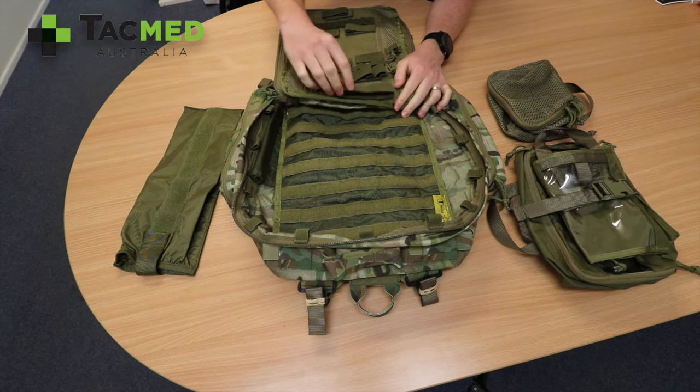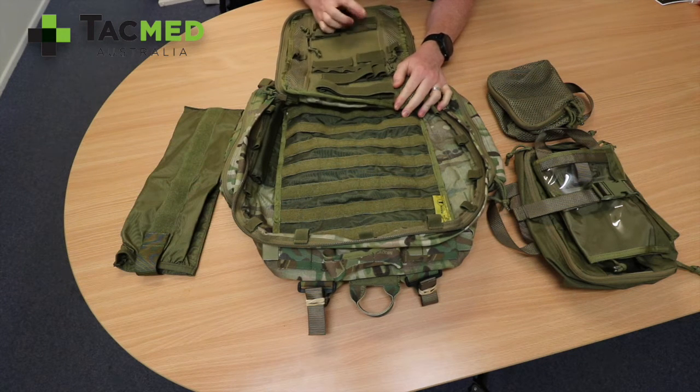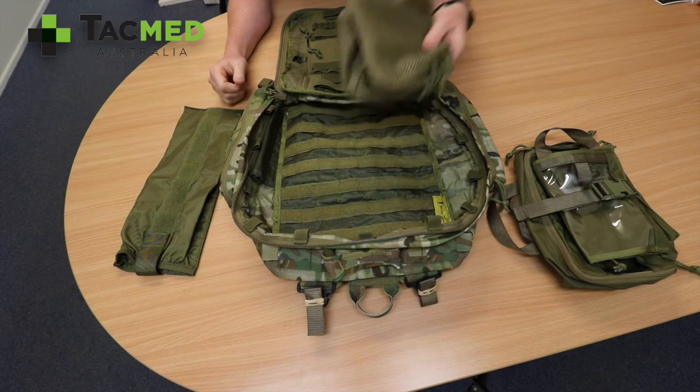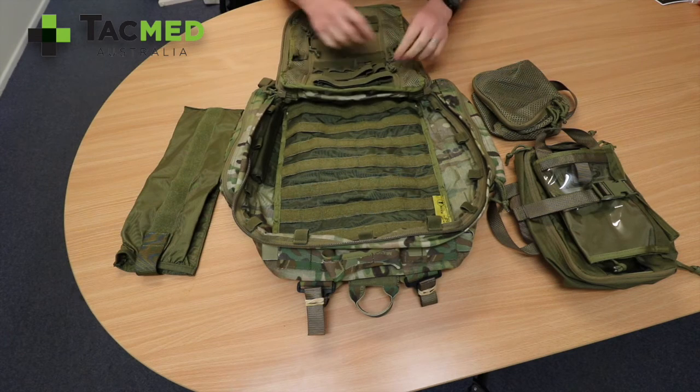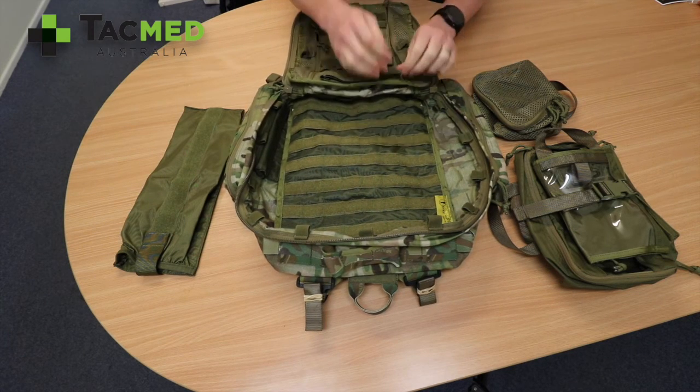On the top there are multiple elastic straps — they're in no particular order and you set them up for whatever you want to use. You can also remove them and place items on the lid or any velcro pouch. There's some further storage on the inside as well.